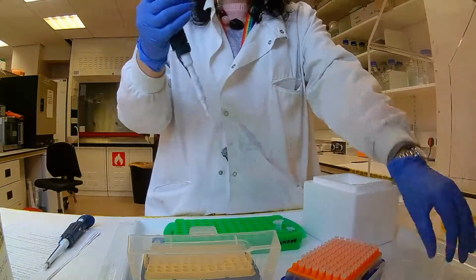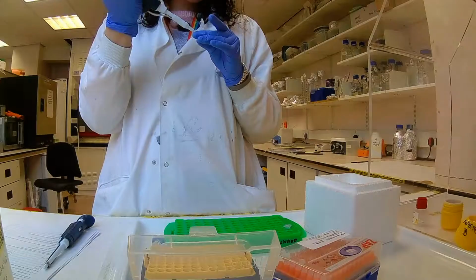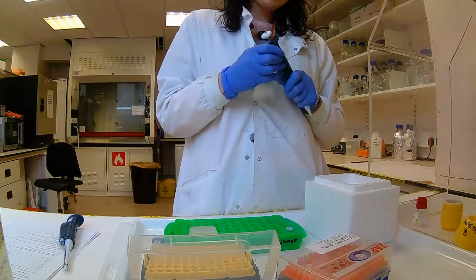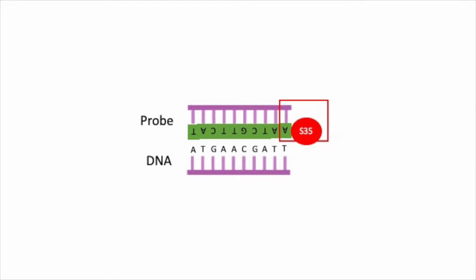I use radioactive sulfur, S35, which is bound to an adenine nucleotide. I set up a reaction in which an enzyme basically just adds this extra radioactively bound nucleotide to the sequence of probe that I have. After cleanup to get rid of all the extra stuff in the mixture, I am left with probes that have this extra adenine with the S35 attached to it.